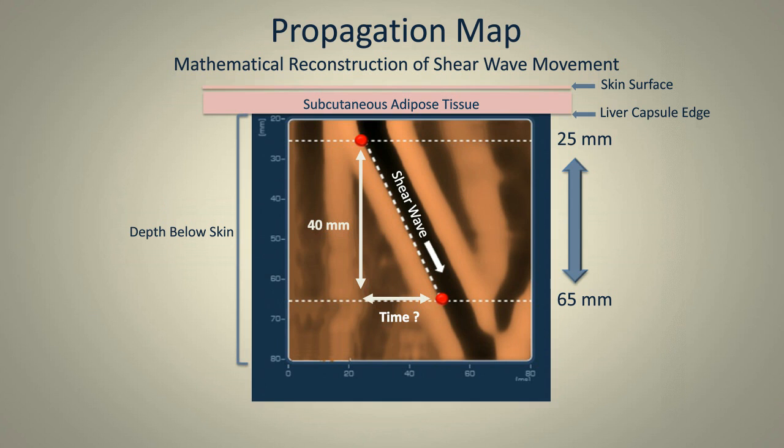But ultimately here, on this slide, you're measuring about 40 millimeters of liver tissue. It starts about 25 millimeters below the surface of the skin and goes to about 65 millimeters. So ultimately, the key is to ensure that you're in the liver when this transducer actually starts measuring the liver. It becomes a little bit complicated when you have a morbidly obese person where your skin surface to liver capsule edge is more than 25 millimeters. And I know that the company is working on some technology to help with that.